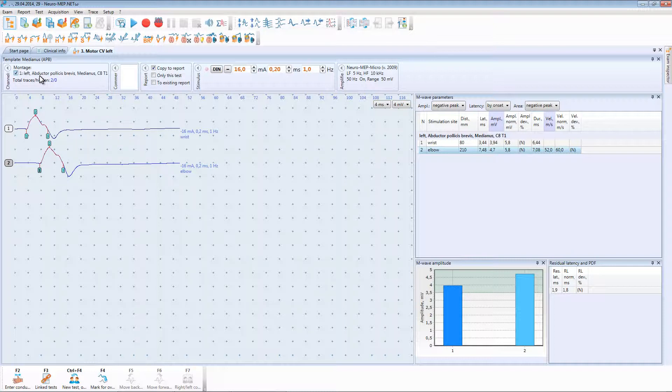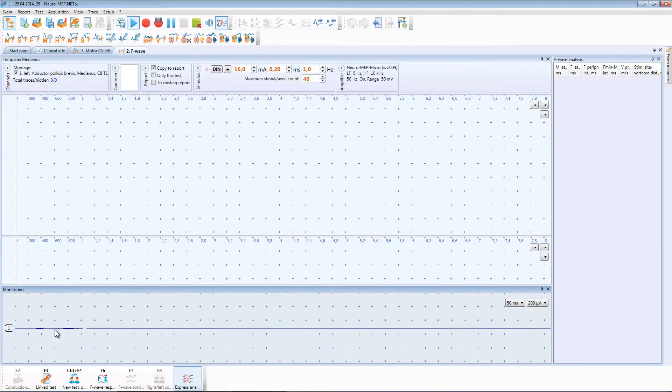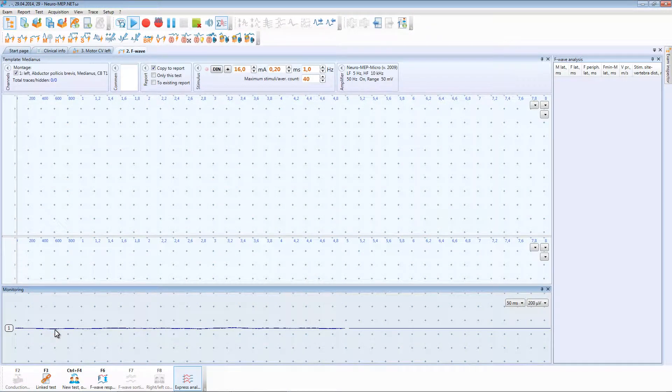To create the linked test press F3 button and choose the required test from the list of available tests. At that the F-wave window opens.